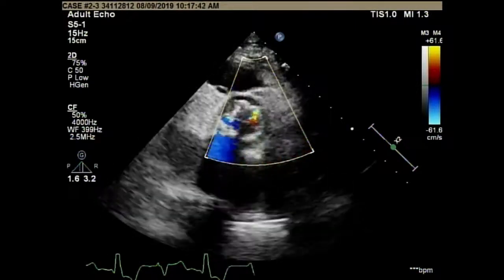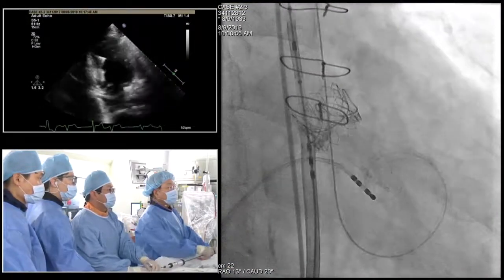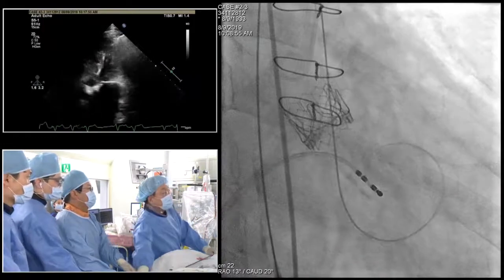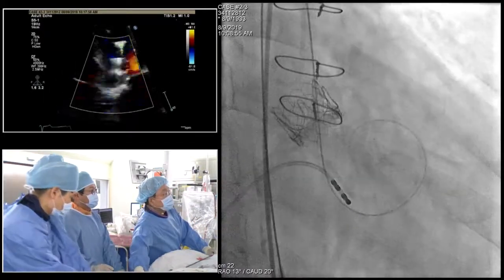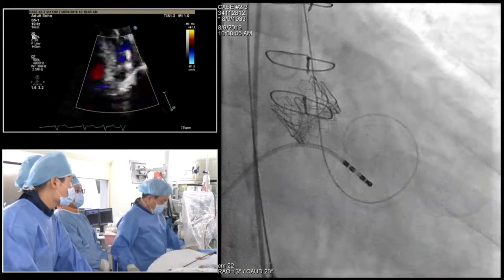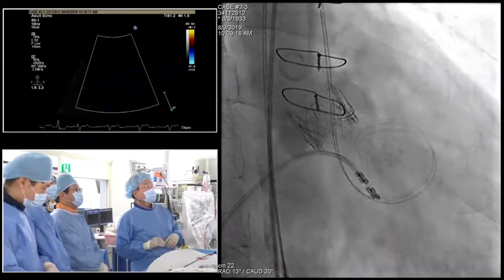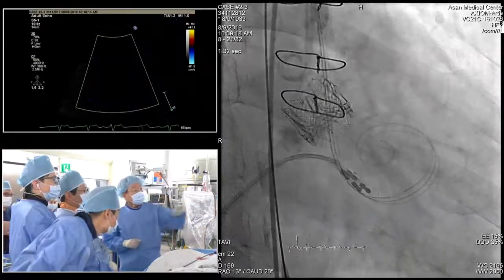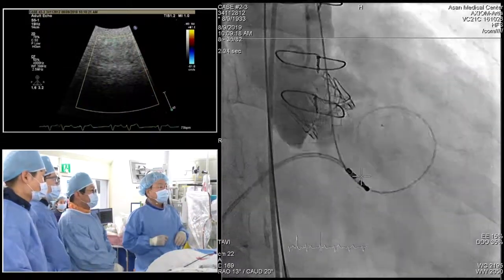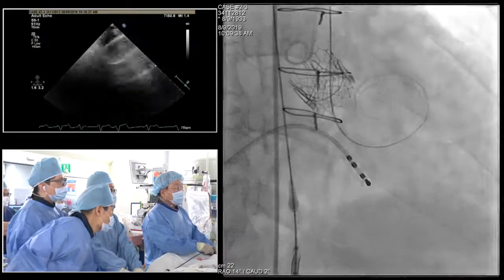Okay, so why not? I'll move to the apical image. Okay, here is more clear. I want to take a picture first. Pull the wires further. I don't want tension like that. Okay, full shot. So there is something, but hopefully that's just wire. Mainly wire related, right? So put the pigtail and then see if it goes away. Get hemodynamics too. All right. Procedure-wise, I think it is very straightforward.